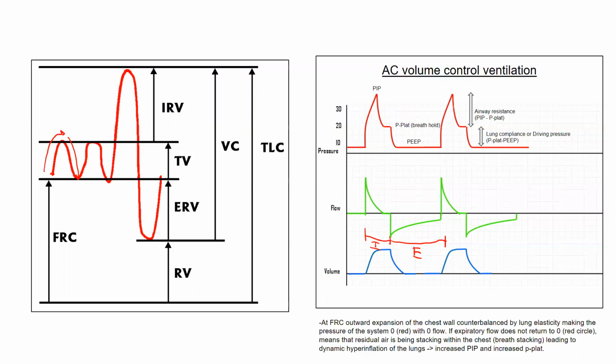So what was going on with this patient is she had asthma, and we were not allowing her to expire. She's inspiring normally, but because she has so much bronchoconstriction going on, she's going to have dynamic airway collapse, and it's going to take her longer to expire. So COPD or asthmatics need to have a higher expiratory time. So you can see her expiring right here.